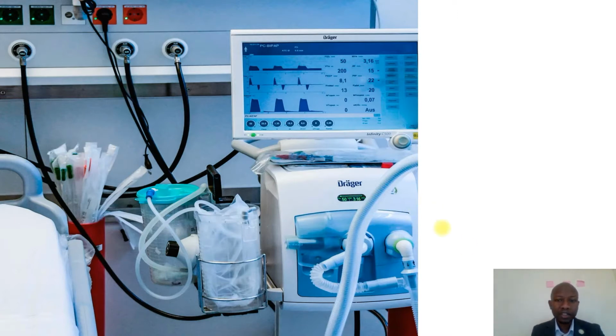Okay guys, so this is the ventilator. This is the machine that is used to help us in oxygenating the patient by transfer of oxygen from its own system to the patient's airway. As you can see, it has a screen here. Here we can adjust several settings like the IE ratio, the ventilator mode itself, the tidal volume, and many other settings. I think I should do one video some time, and help you to understand some of these things on the ventilator.